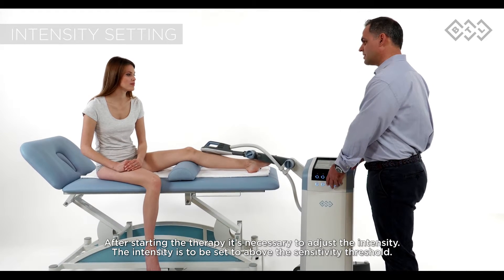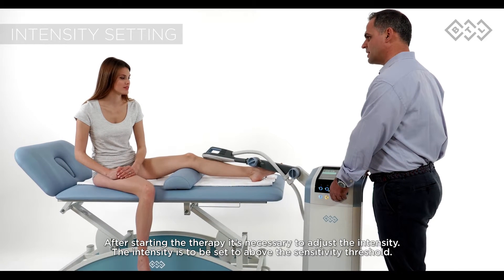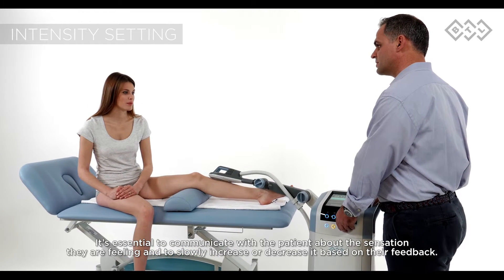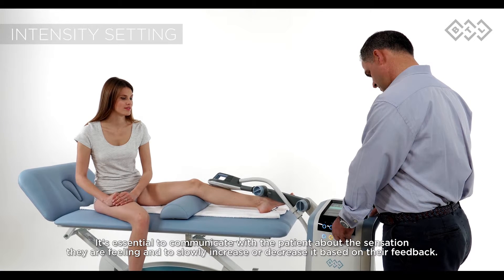After starting the therapy, it's necessary to adjust the intensity. The intensity is to be set to above the sensitivity threshold. It's essential to communicate with the patient about the sensation they are feeling and to slowly increase or decrease it based on their feedback.